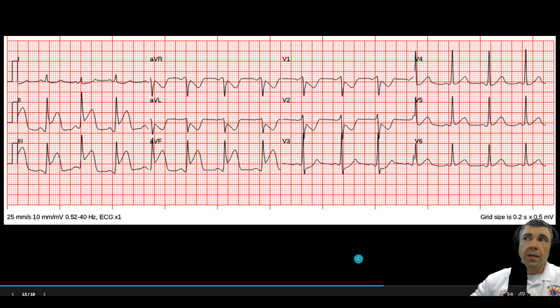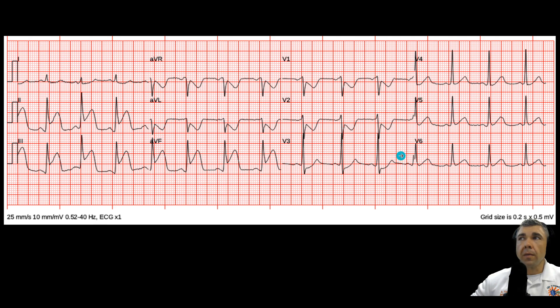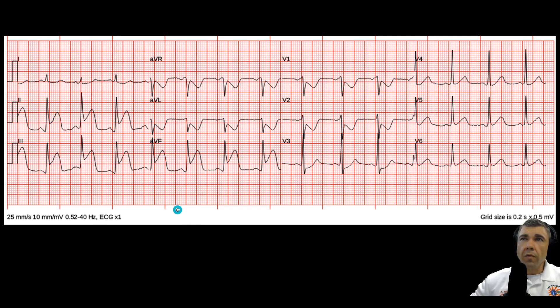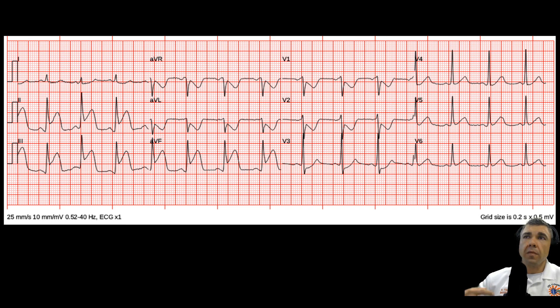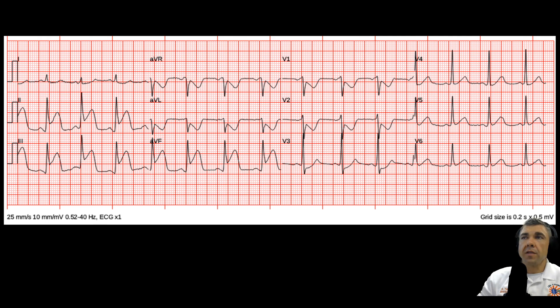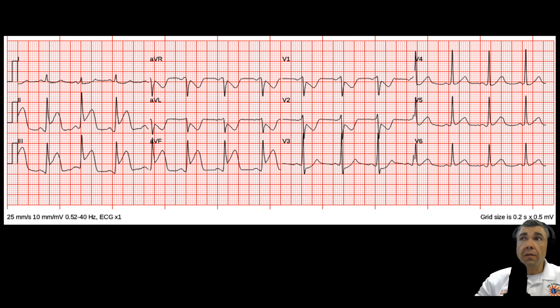Now look at this 12-lead. This should be pretty obvious — it's an obvious infero-posterior wall MI. This patient has what's called a dominant RCA occlusion. The right coronary artery, in over 85% of people, supplies the posterior descending artery, which provides blood flow to the posterior wall of the heart. So a dominant RCA occlusion causes both inferior and posterior wall MI. In a small percentage of people, the posterior descending comes from the left circumflex, which would make it more of a lateral-posterior wall MI.